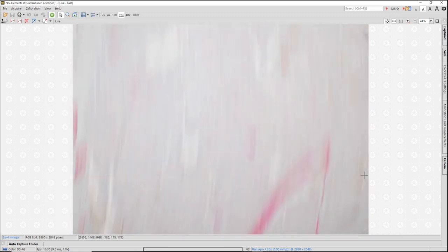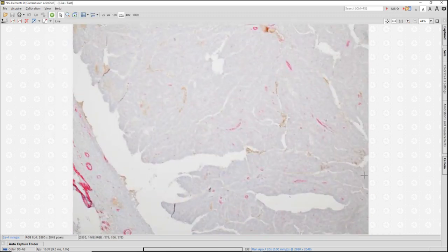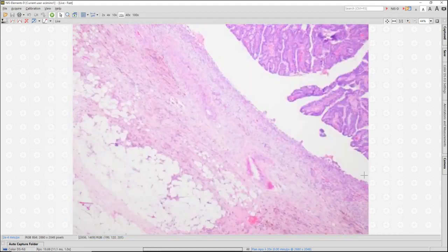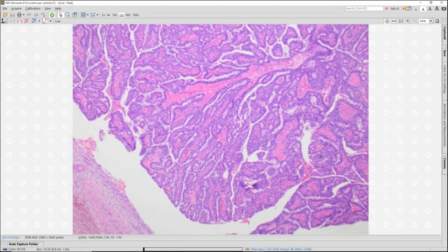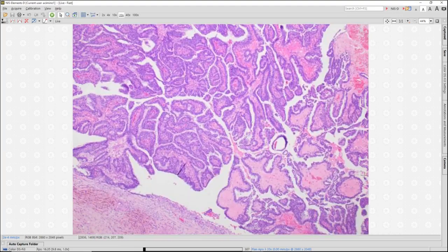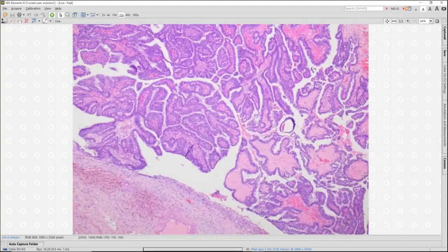So this is important to recognize because unlike benign intraductal papillomas, it does require excision. We want to evaluate the whole lesion to look for any conventional invasive carcinoma patterns, okay? This alone by itself is just staged, again, as PTIS. It's managed like carcinoma in situ. What we want to exclude is any definite invasive conventional ductal carcinoma, right? So this is encapsulated papillary carcinoma.